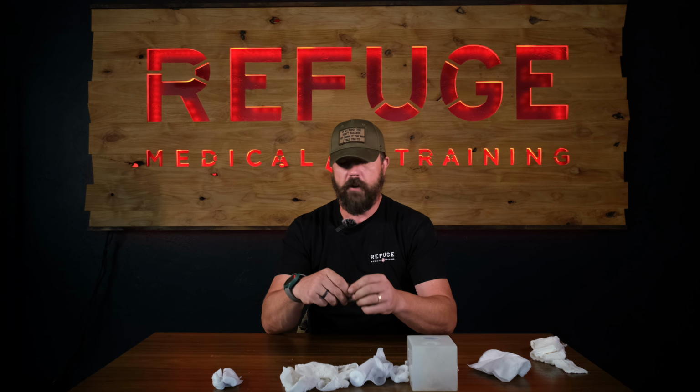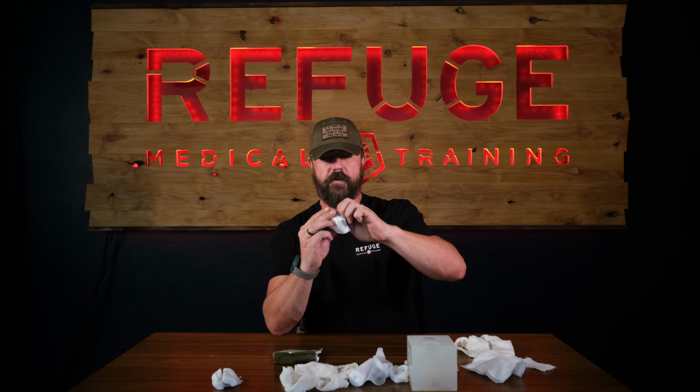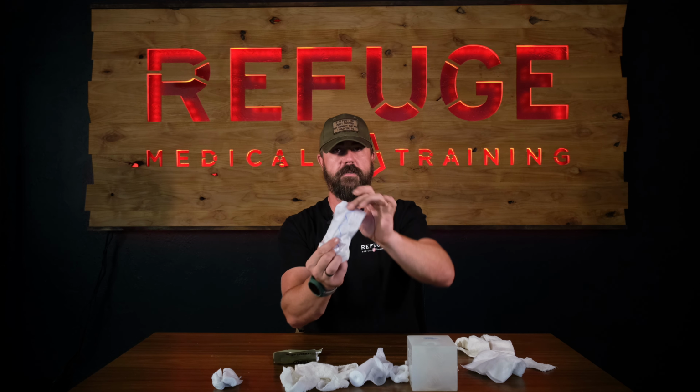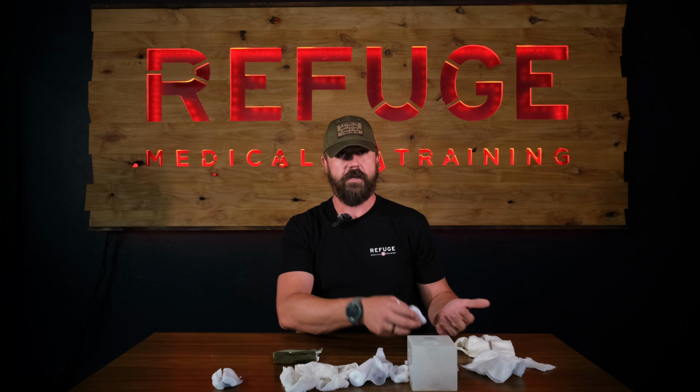So that is the standard QuikClot, and then we also have what is affectionately called combat gauze, right? And this is a Z-fold variety of the same thing. It's just like that other Z-fold gauze here, right? Except for this one folds widthwise instead of lengthwise, and you see that it has this blue band through it. Again, this is so that you drive this to the source of the bleeding, and it helps stop that bleeding, create a clot.